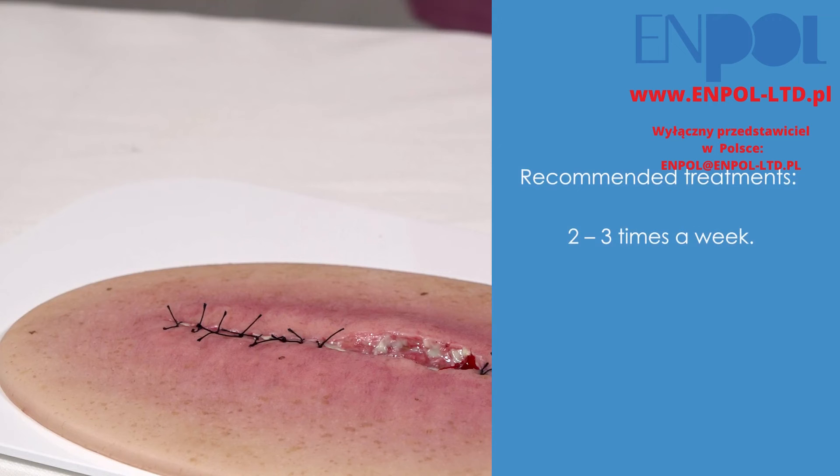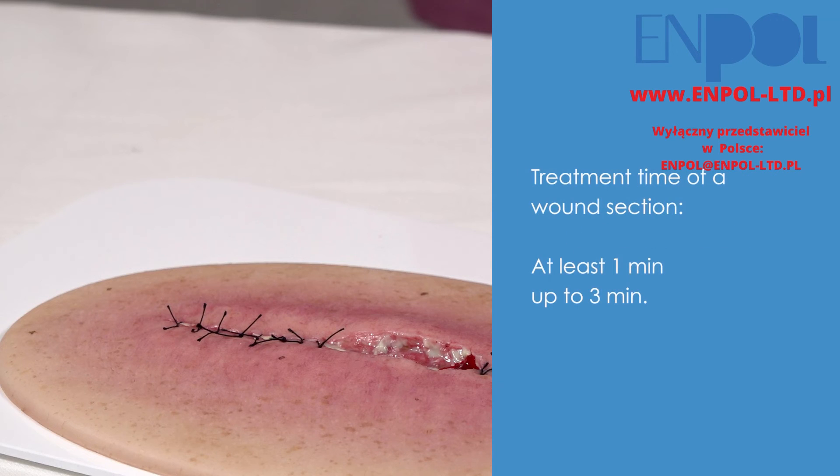We recommend treatment 2-3 times a week for 1-3 minutes. In some cases, one treatment per week may be sufficient. A wound area should be treated for at least 60 seconds. Wounds with a high load of bacteria or multi-resistant pathogens can be treated for up to 3 minutes.